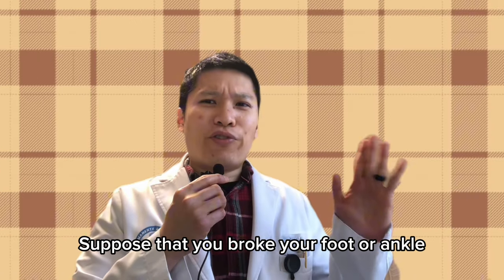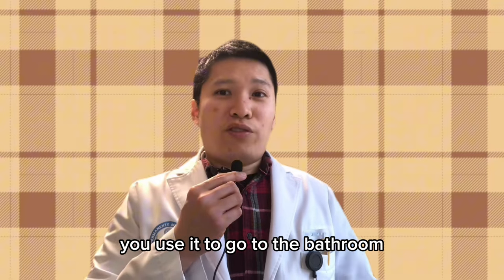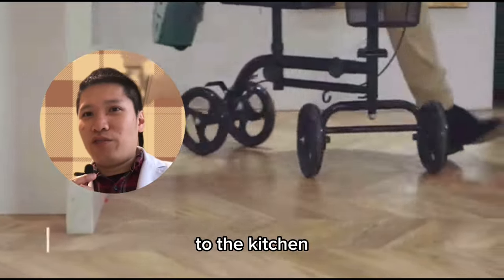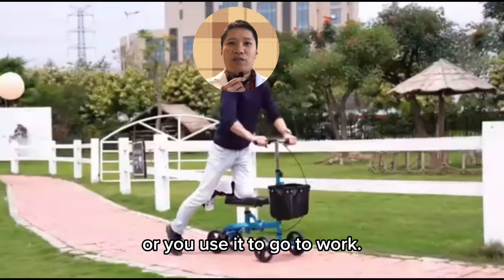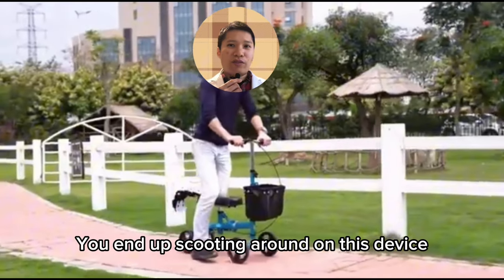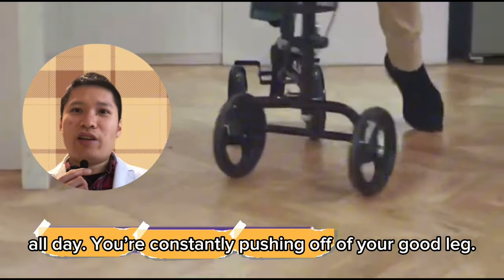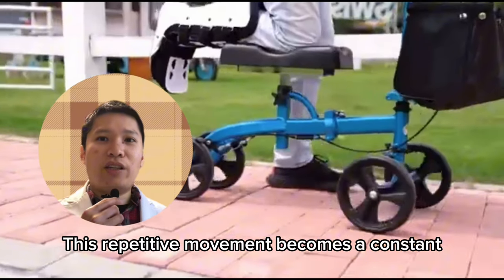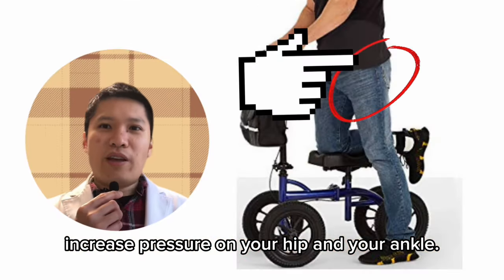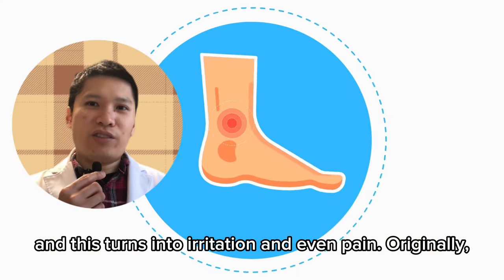Suppose that you broke your foot or ankle and you're using this knee scooter. You use it to go to the bathroom or the kitchen, to class, or to work — you end up scooting around on this device all day. You're constantly pushing off of your good leg, and this repetitive movement creates a constant increased pressure on your hip and your ankle, turning into irritation and even pain.